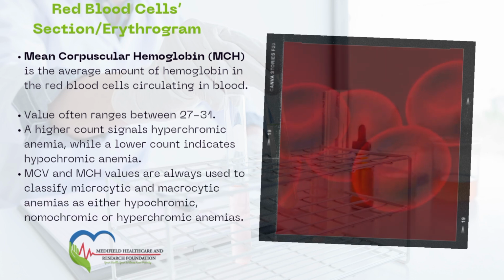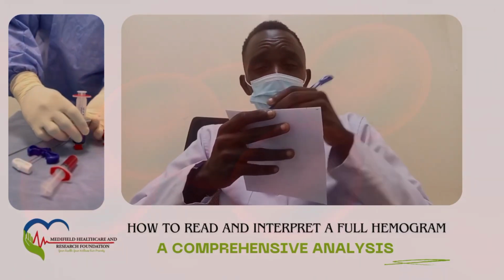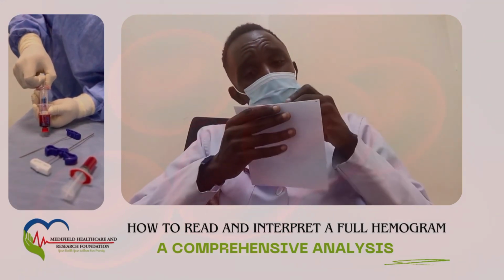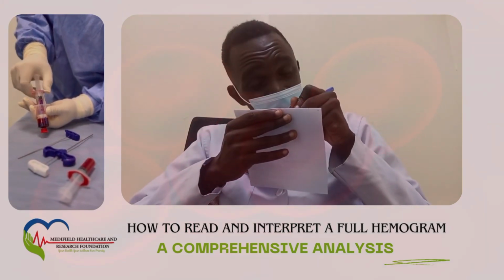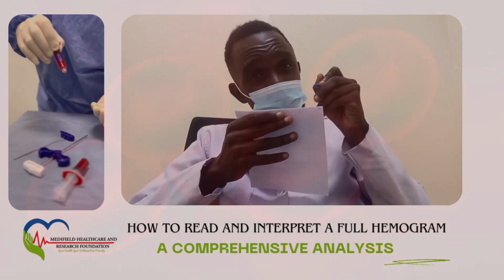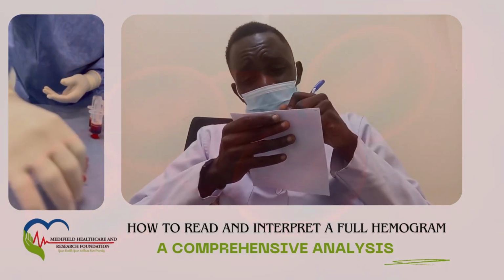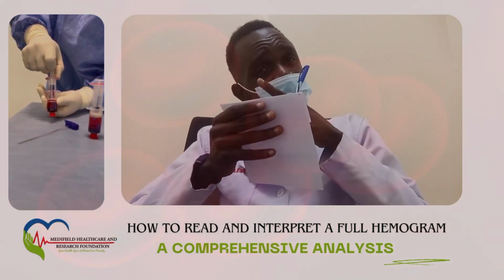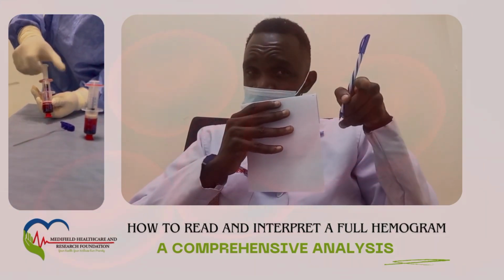So MCV and MCH values are used to classify macrocytic and microcytic anemias. We could have a low MCV, a high MCH. Then that means we have a microcytic hyperchromic anemia. If it is a high MCV, a low MCH, then we have macrocytic hypochromic anemia.